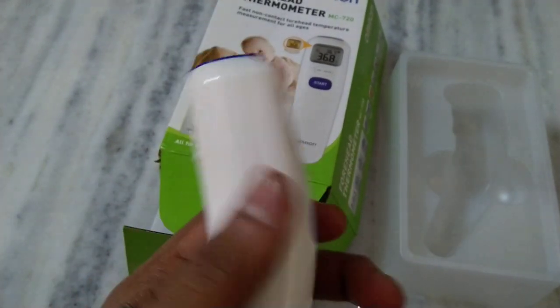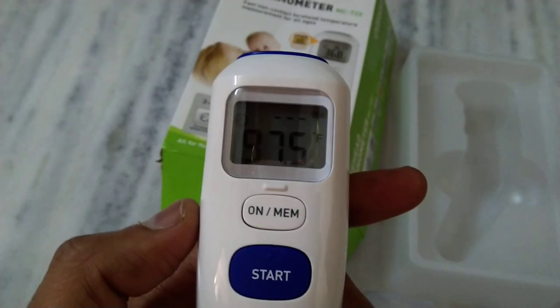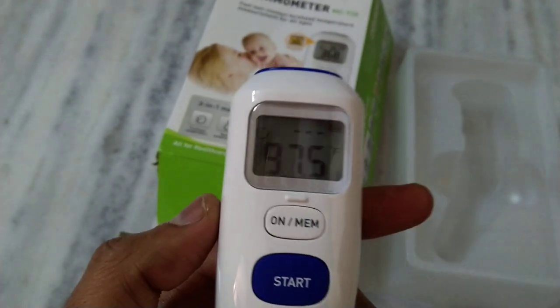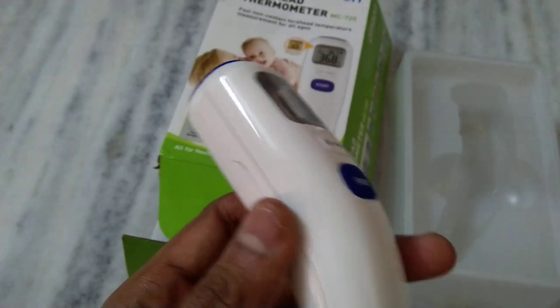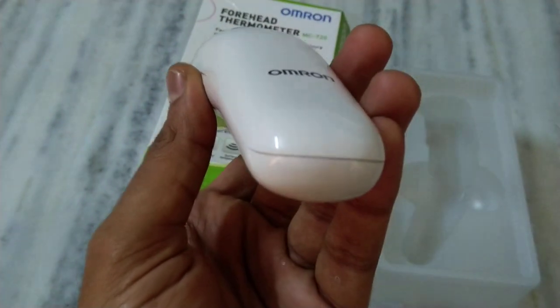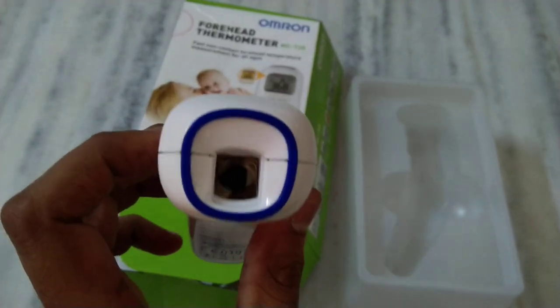There is a strip inside the device that you need to pull off before using it. That strip is there to protect the battery and prevent it from draining. Once the strip is removed, the thermometer starts operating.